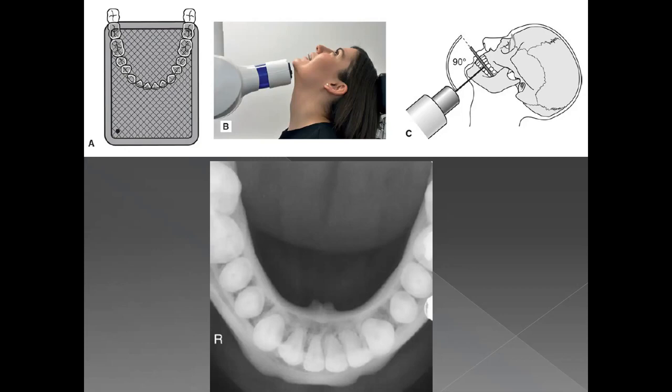However, one modification that I do personally, where a patient cannot flex their head that much, is that you simply tilt the X-ray beam, pointing it completely upwards, and you ask the patient to put their chin on top of the X-ray beam. For that, they may have to get out of the dental chair and stand up, because usually our X-ray generators cannot bend down to such a level that it can be performed in the chair.